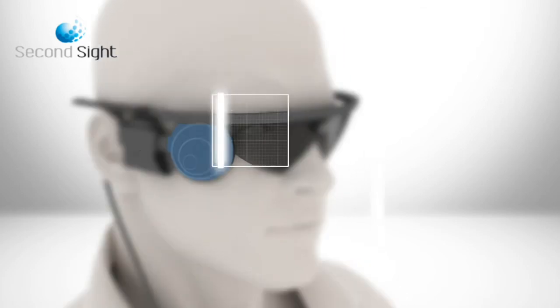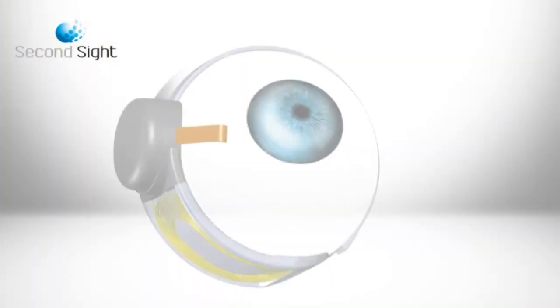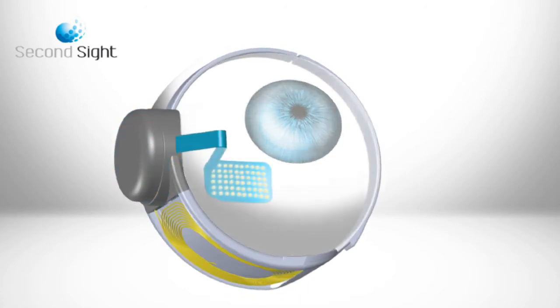These instructions are then transmitted wirelessly to the implant on the eye. The implant consists of a receiver and an array of electrodes.